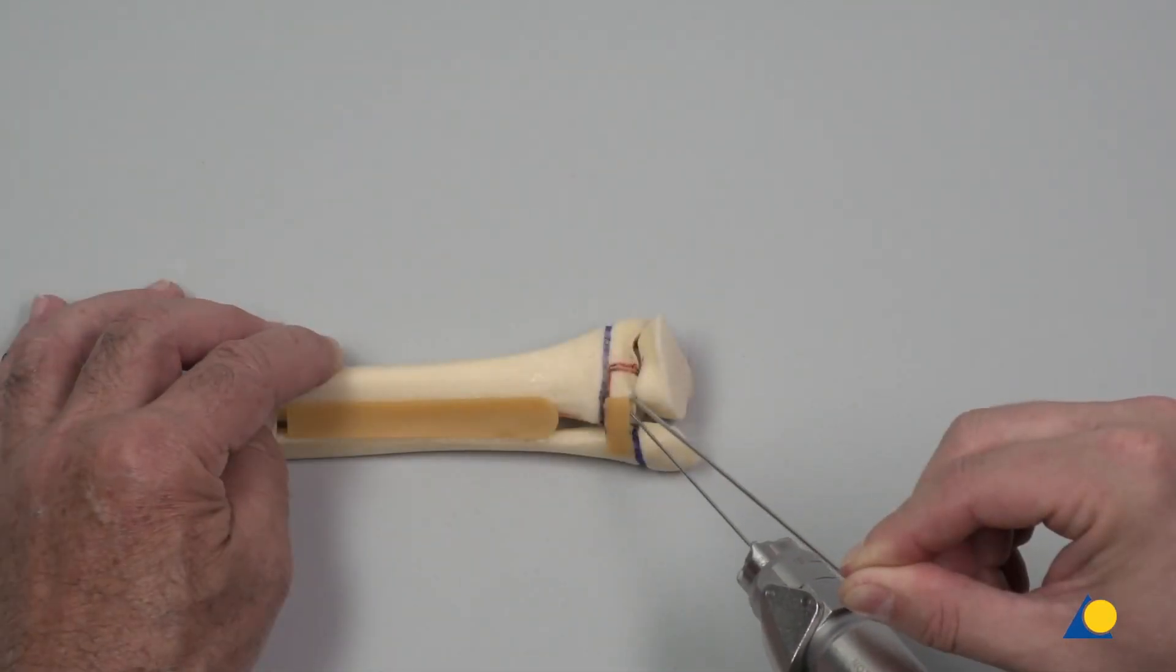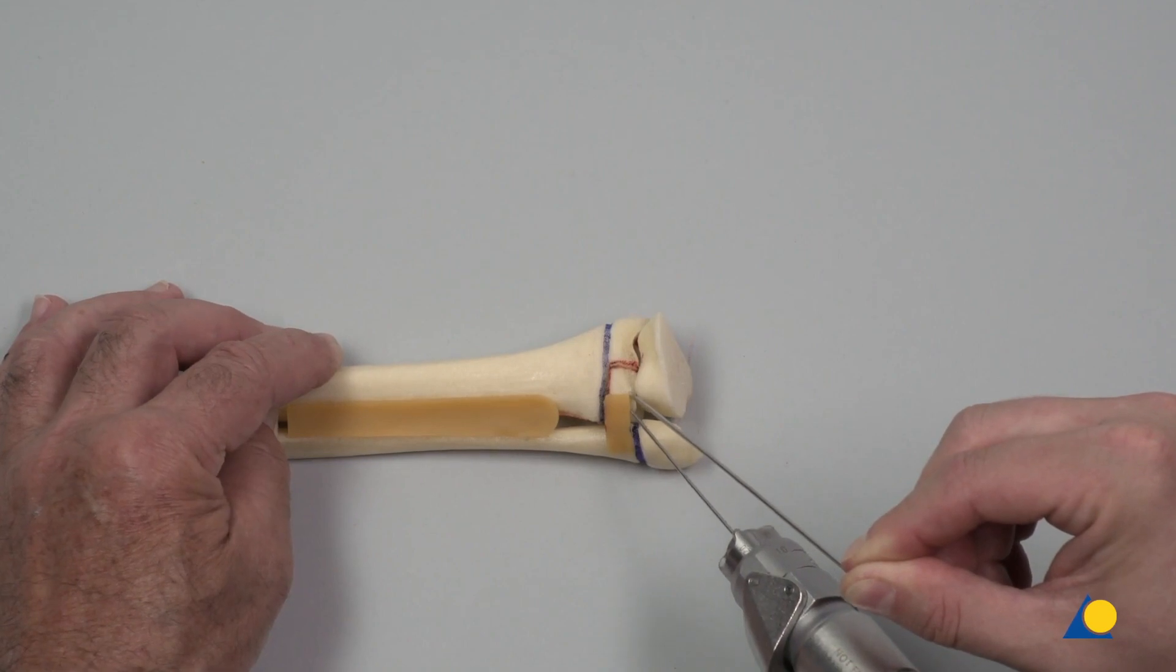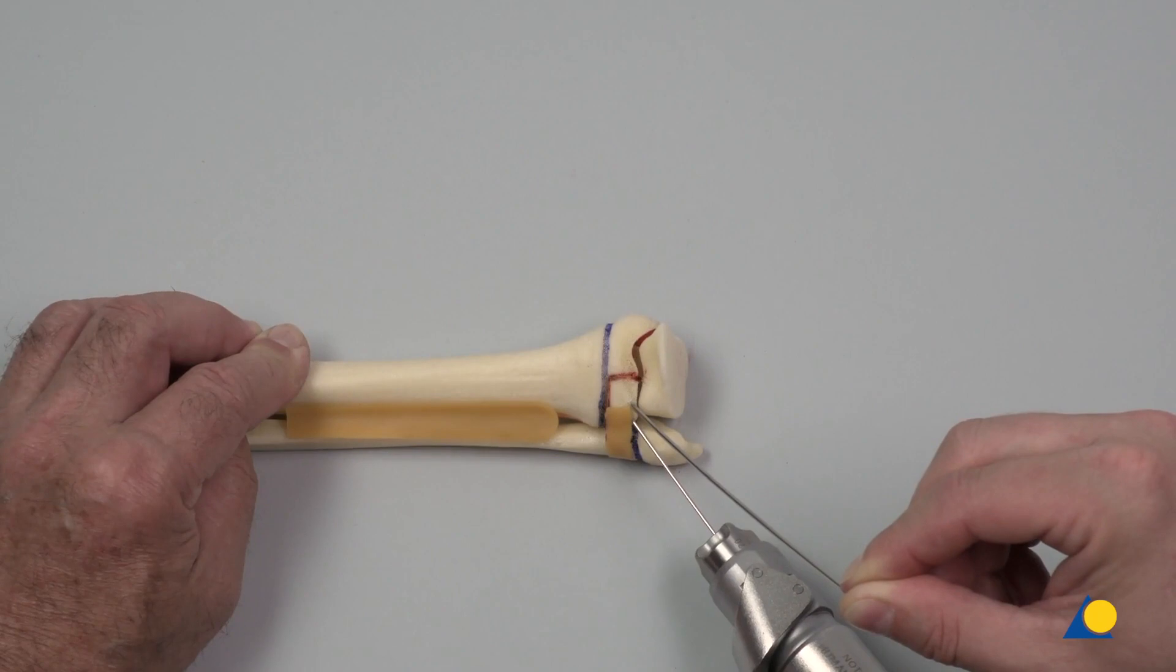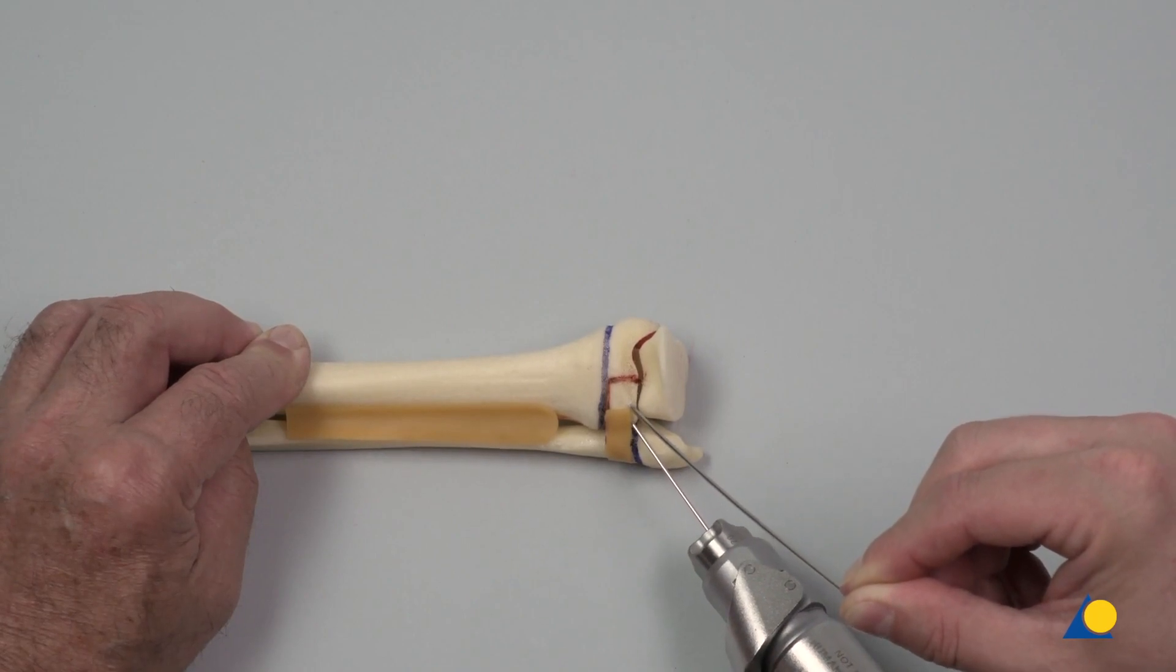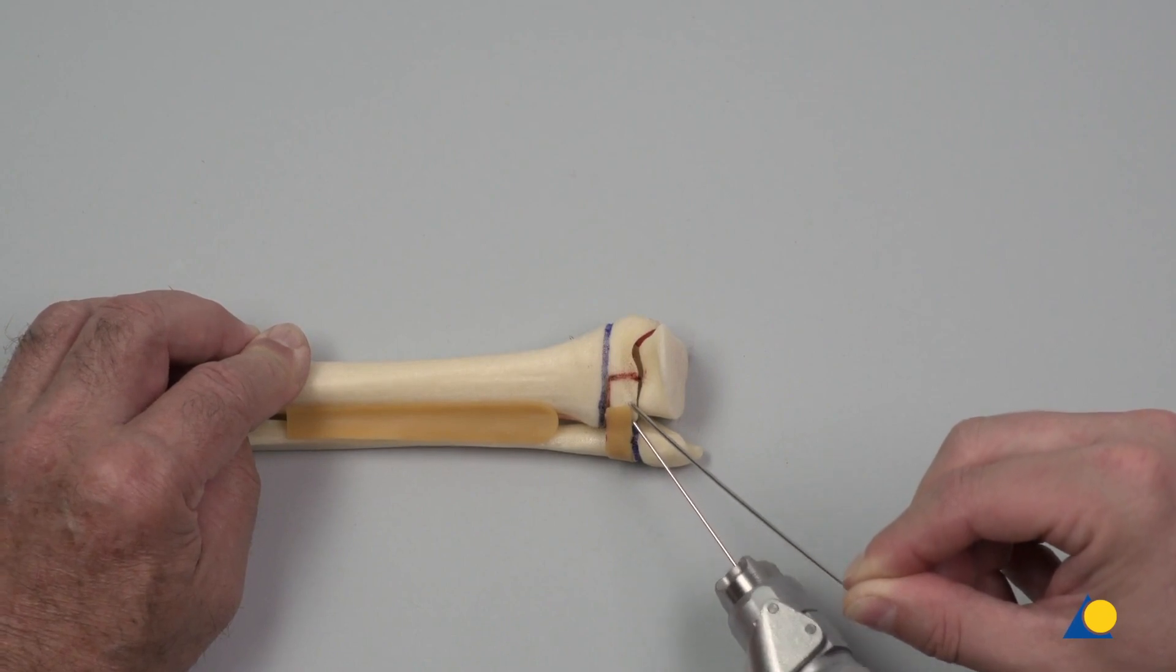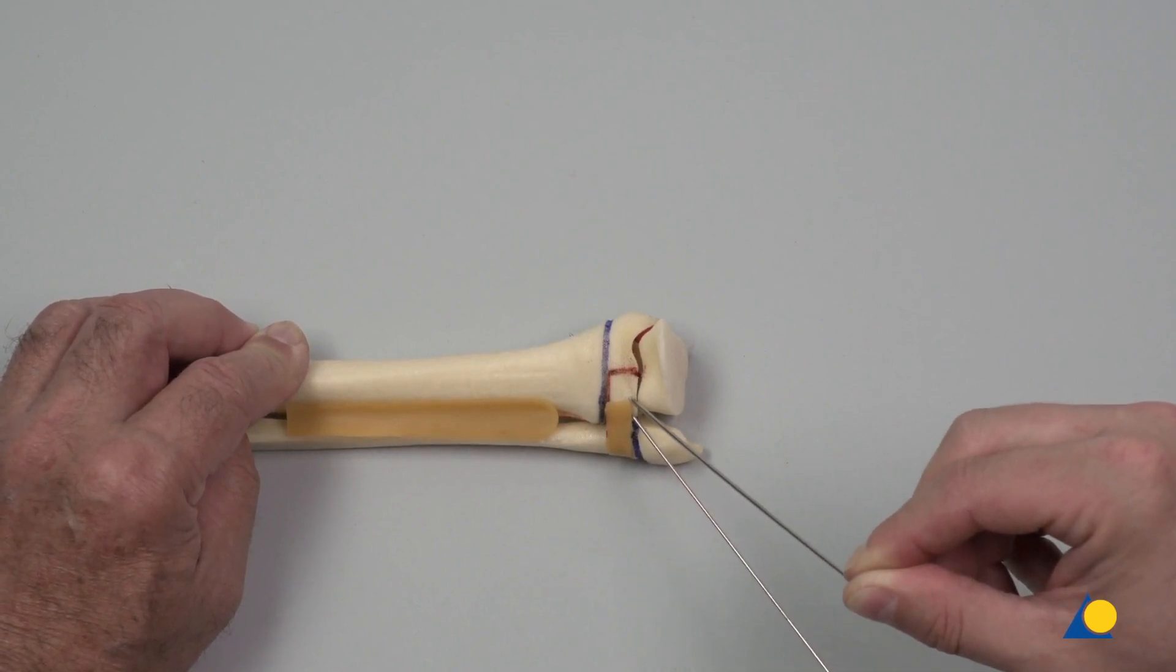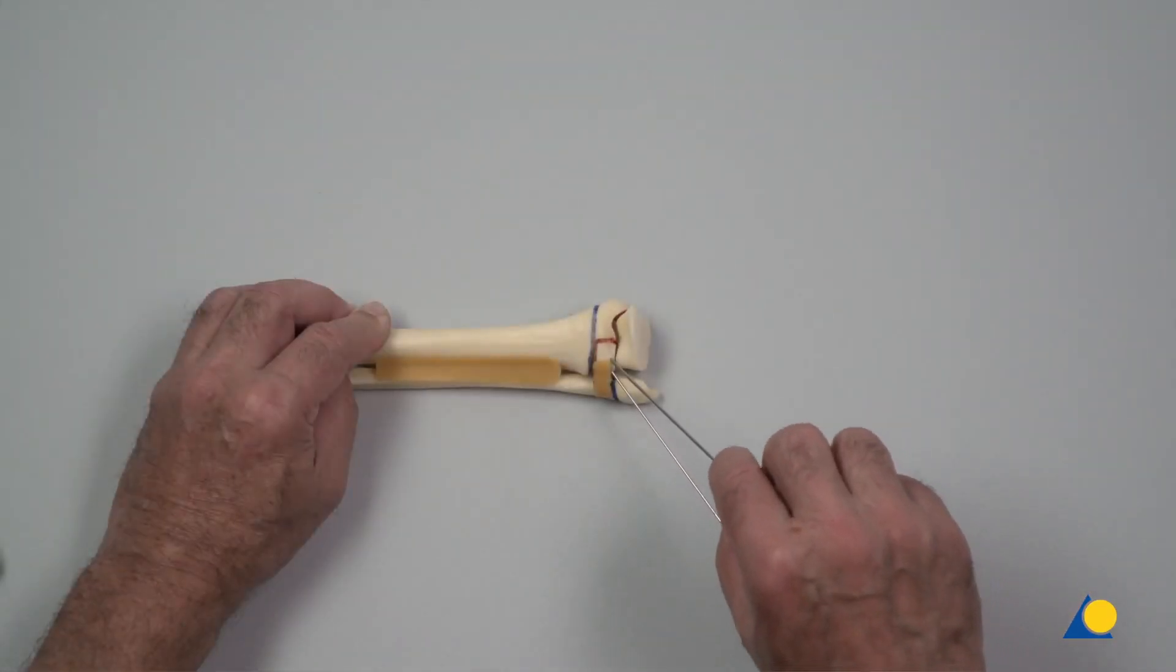After anatomically correct reduction has been achieved, the 1.25 mm guide wire with threaded tip is advanced to the contralateral cortex. Note the oblique direction of the wire passing the medial side of the almost closed growth plate. The K wire is removed.